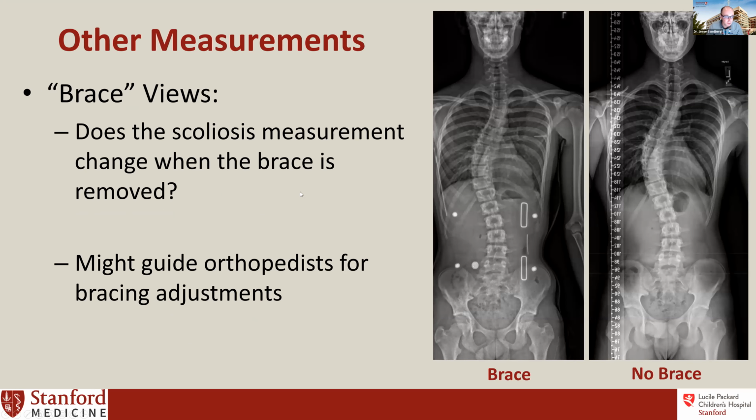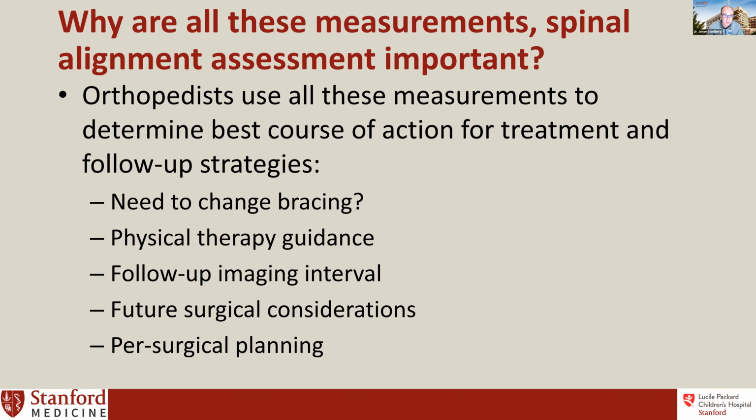And then these brace views, it's more a guidance for the orthopedist. Does the scoliosis measurement change when the brace is in place or not? Is it actually doing its job? Does it need to be adjusted? And many other questions. So to sum that all up, the orthopedists use all these measurements to determine the best course of action for treatment and follow-up strategy.